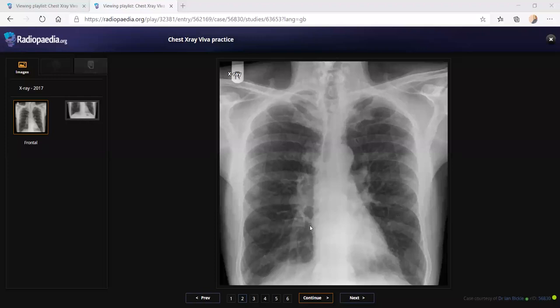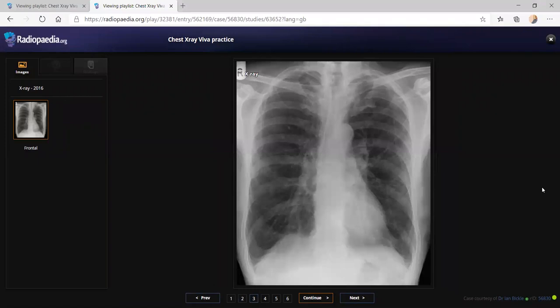Okay. So this is a previous chest x-ray, 1 year back? So 1 year back, I don't find any opacity in this chest x-ray in correlation with the recent film. So I would further advise cross-sectional imaging for this patient to evaluate the hilar mass. What are you thinking? What is your primary diagnosis? It can be a hilar-based tumor, or it can be a lymph node enlargement.